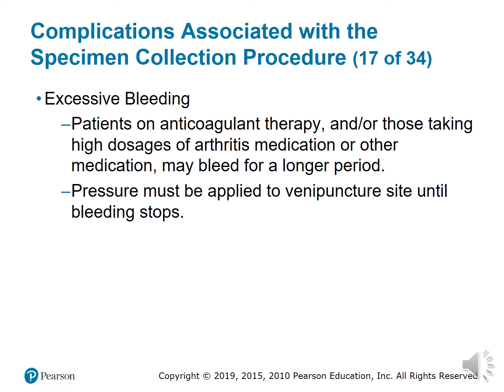If the patient does state the fact that they're on blood thinners, you have the right to ask a patient if they are on one. If they don't voluntarily tell you, you can ask them. That should be part of the questionnaire you ask a patient. Besides, can I get your first and last name, your date of birth? Have you had your blood drawn before? Another question you're supposed to ask is, are you currently on any blood thinners? You're always supposed to ask the patient that also. If they are on one, the last thing you want is for a patient to bleed out on you as they are leaving your site.